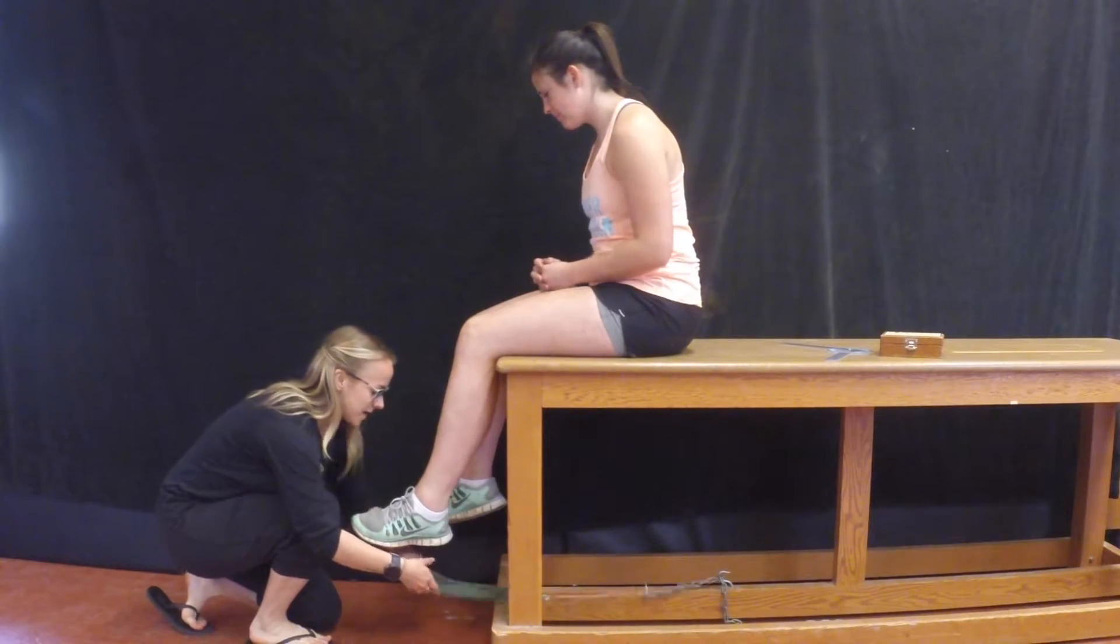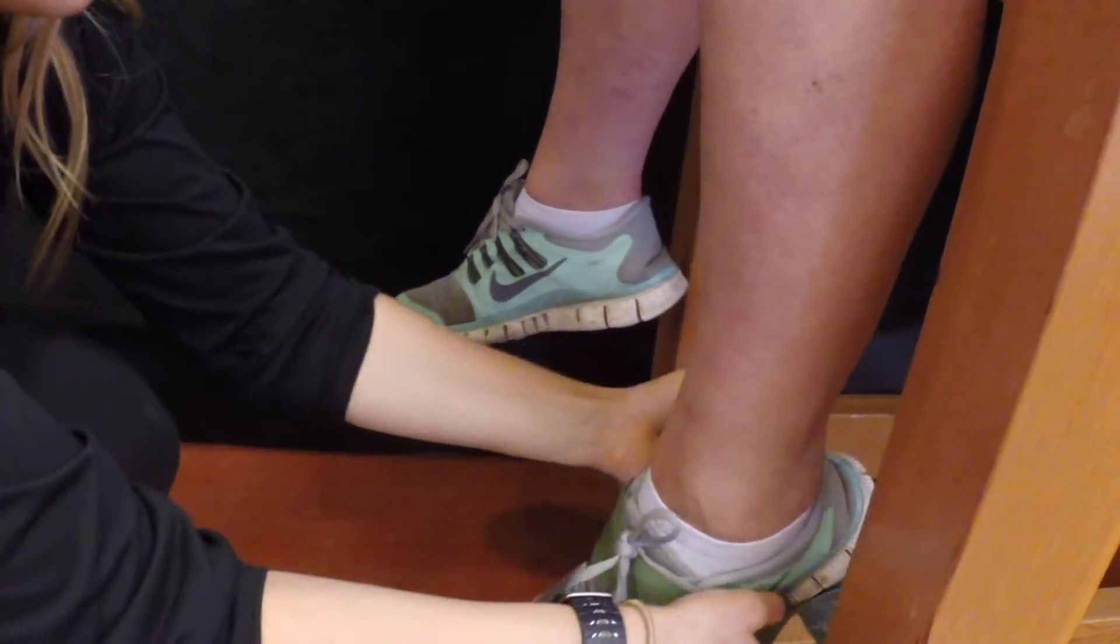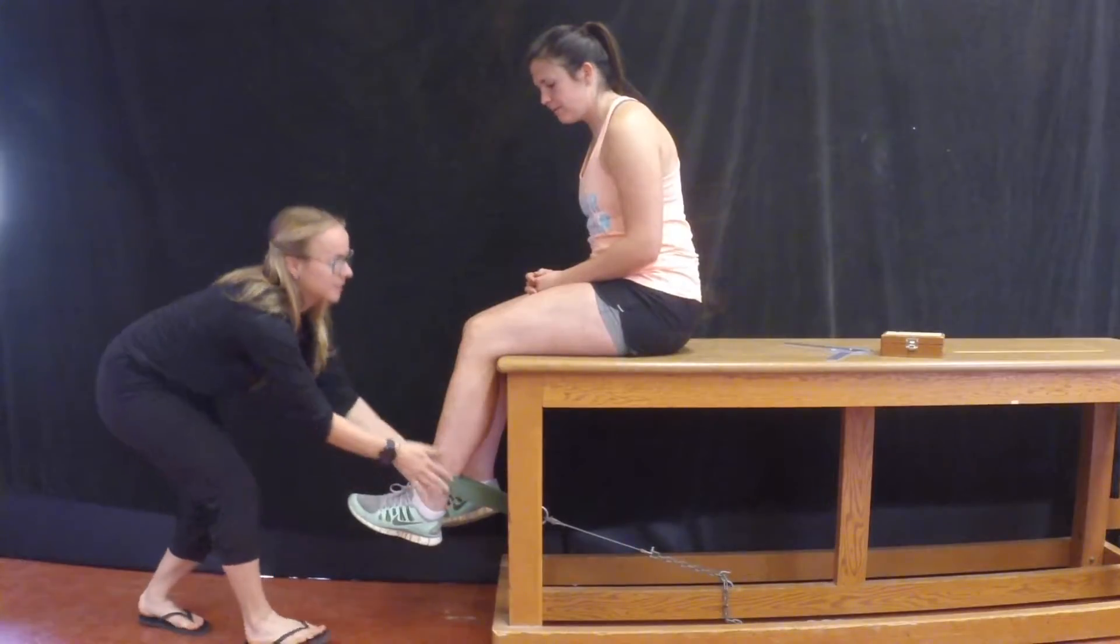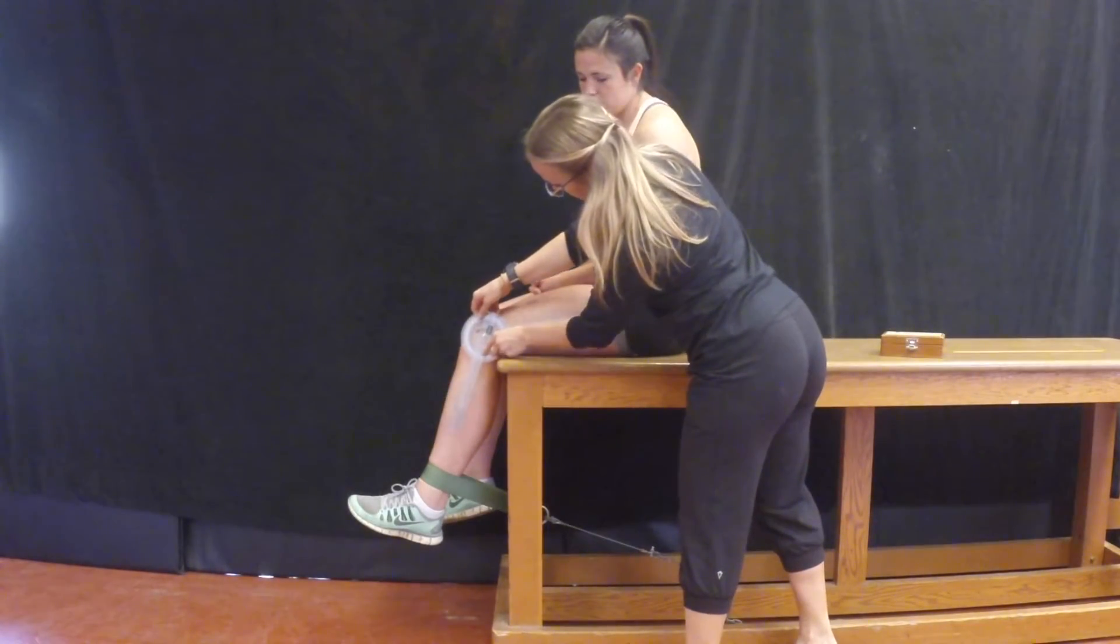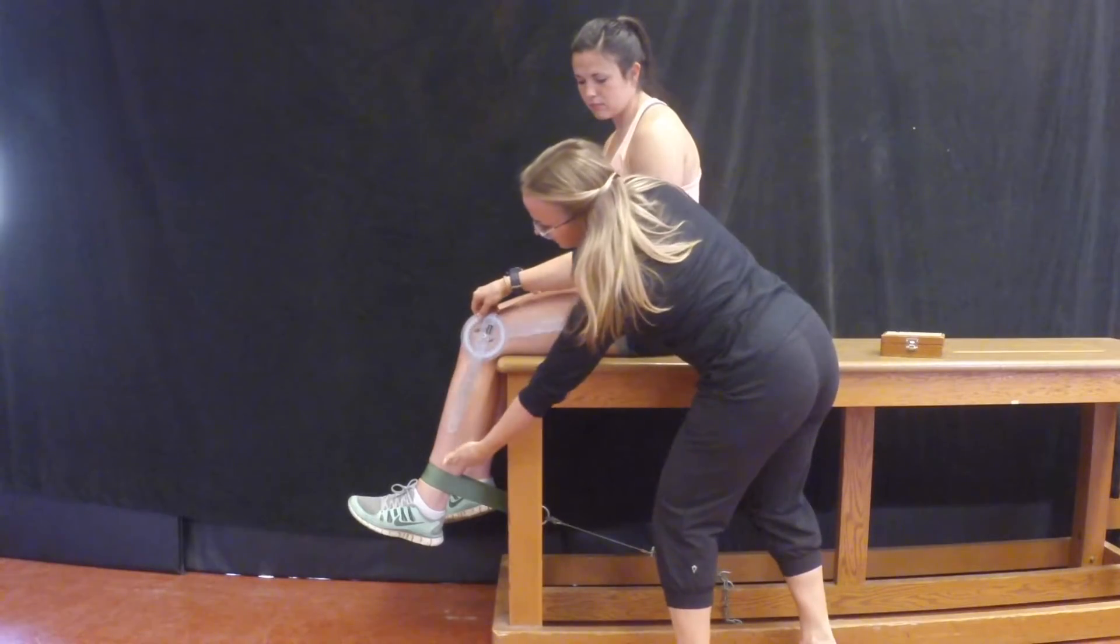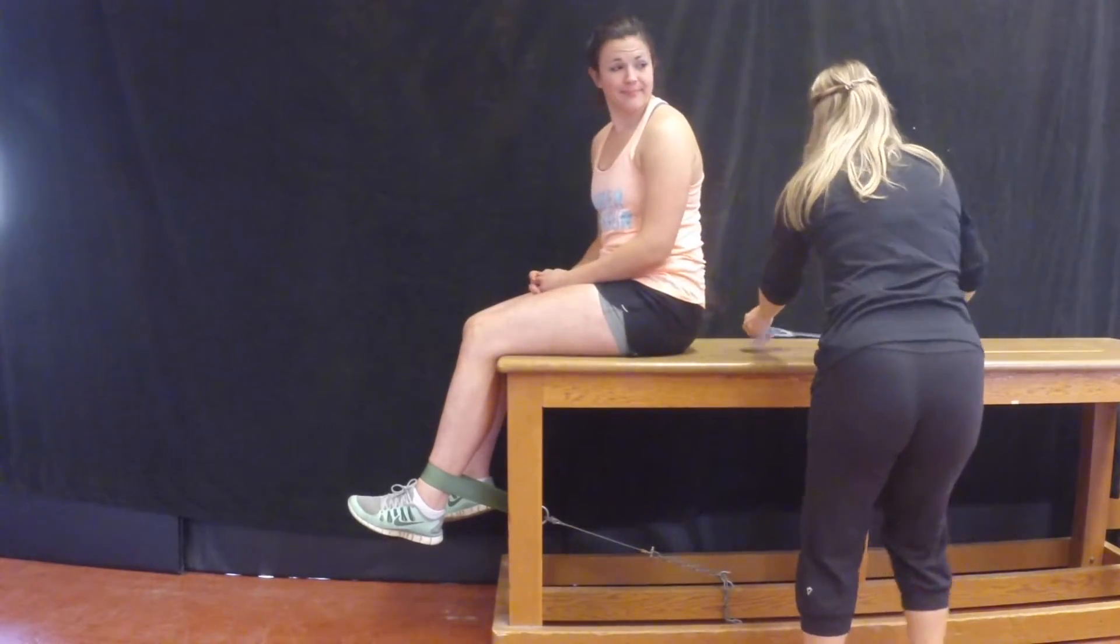Now loop the ankle strap so it sits just above the malleoli. Have your client put slight tension against the cable and check to make sure that your cable length still results in a knee angle of 115 degrees.